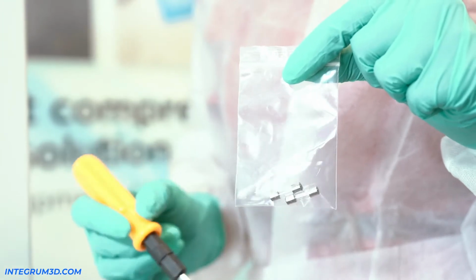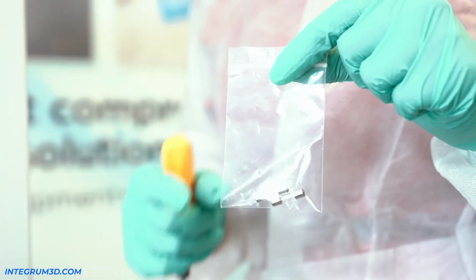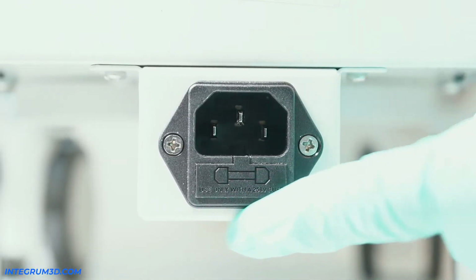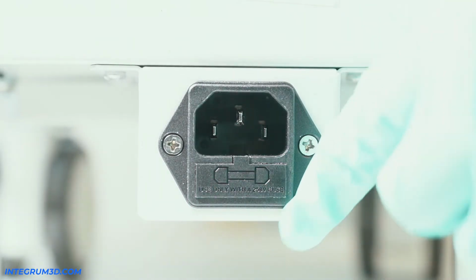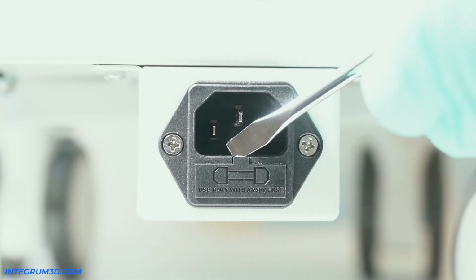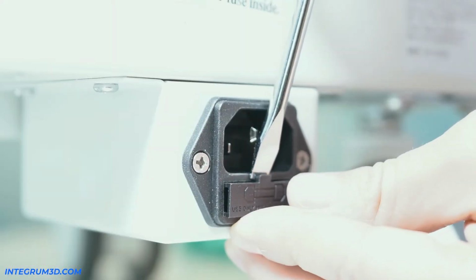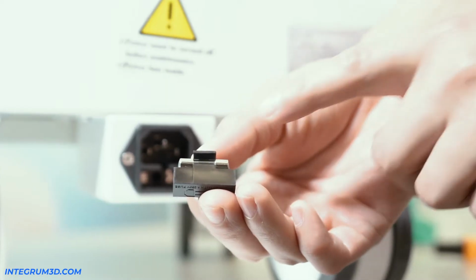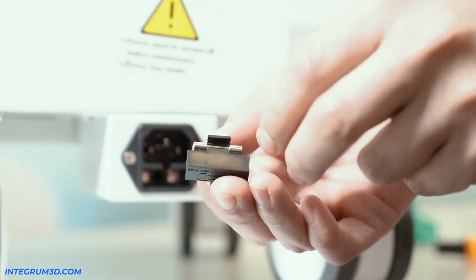In your box, you will be receiving a screwdriver and 2 extra fuses. Your fuse is located in the back here, next to the plug outlet. Use the flathead on the screwdriver to pull this little tab outwards. Then you're going to pull it out completely. Your fuse is sitting nice and tightly inside.